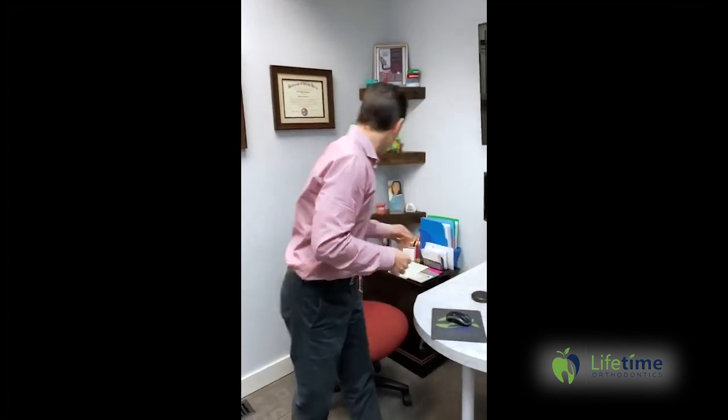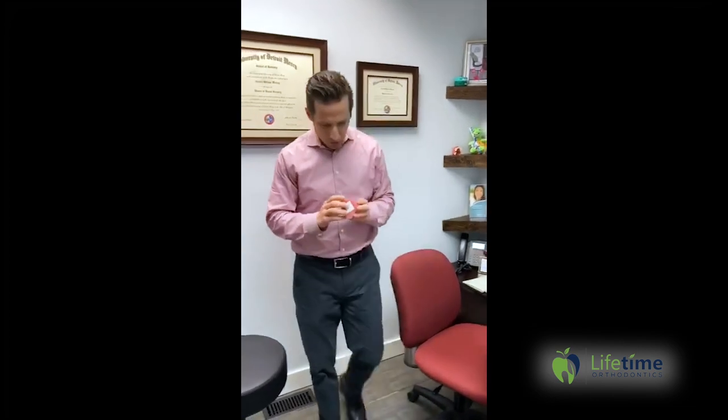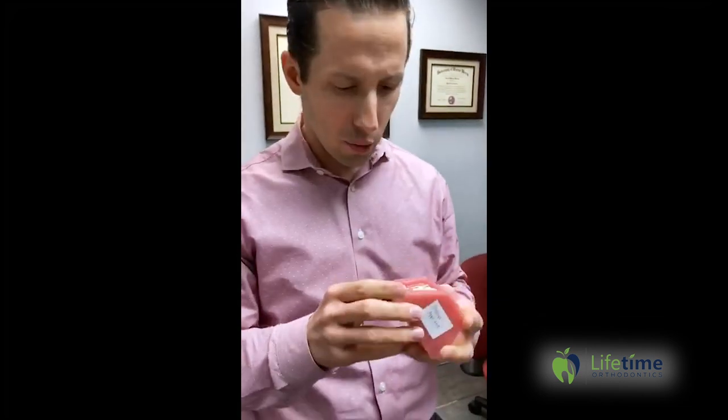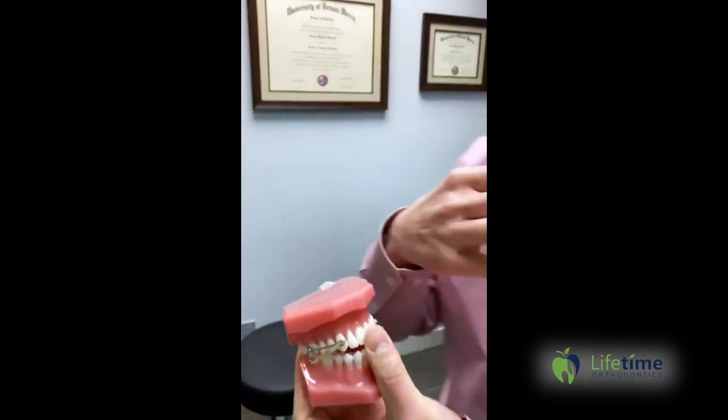Today I'm going to talk a little bit about elastics. If you saw the last episode of my Invisalign journey, at the very end you can see how I struggled to put on my elastics — like most people do the first time. I'm going to show this model, which is a model of the same appliance I have, and you can see here how it's bonded to the teeth. Essentially, you need to wear these elastics.